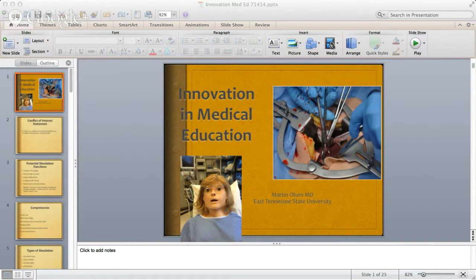Now, she also has a patient safety focus because we could do patient safety drills with her. So, for example, she could come into the emergency room, maybe even brought in by an ambulance. She has a diagnosis of ruptured ectopic pregnancy. We see how long it takes the ER docs to make the diagnosis. We see how long it takes her to go to the operating room. We see how long it takes the anesthesia to arrive, the surgeons, gynecologists to arrive and do the procedure. So that would be an example of her patient safety capabilities.